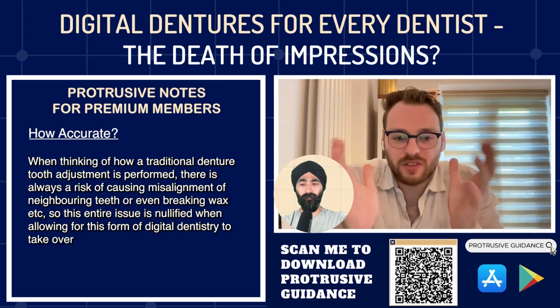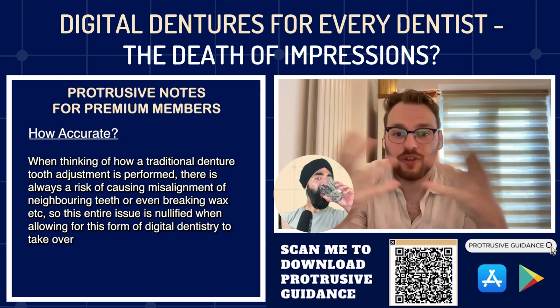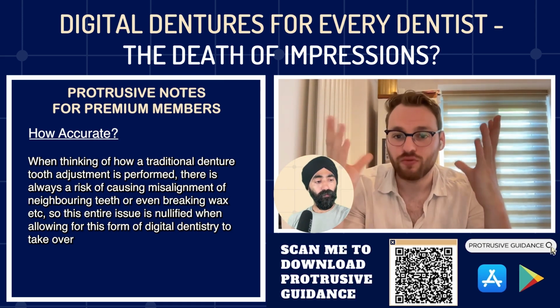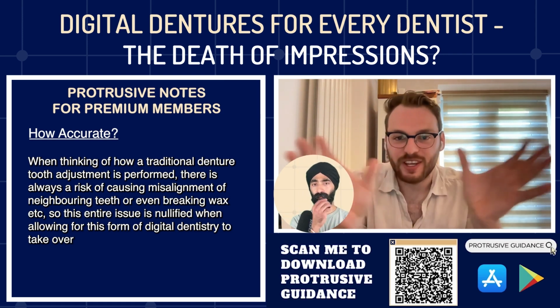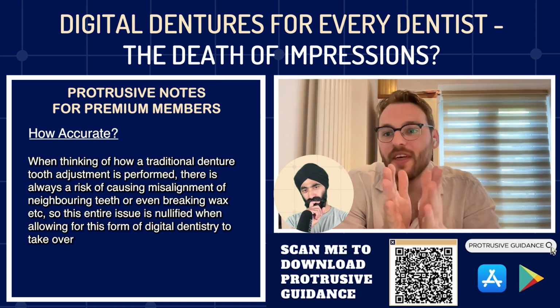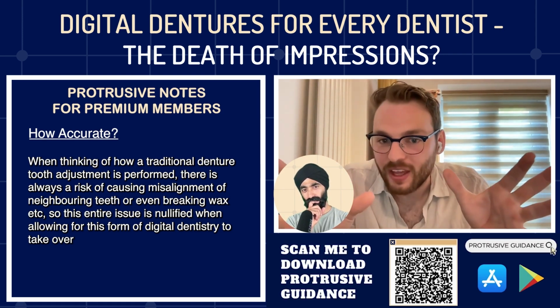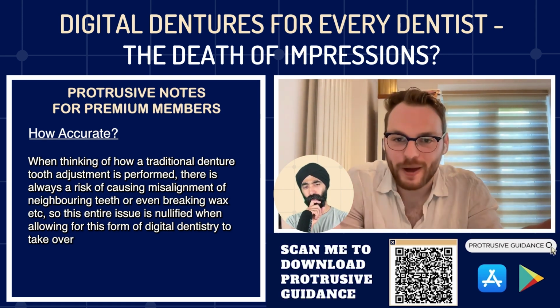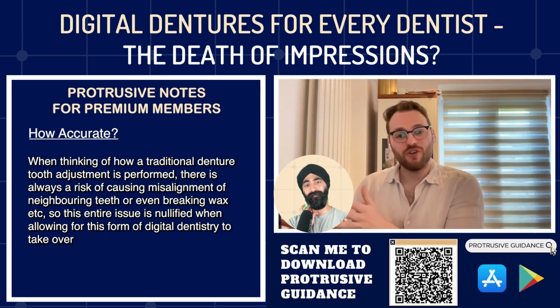But you can always still tweak and polish as if it's almost a set denture, because it's on this full printed monoblock base. It's rock solid. So you can sit there and adjust it. The teeth aren't going to move and they're not going to break off. And then the technician or yourself can even scan that back in and just copy that, a bit like how you do a mock-up in the mouth for a veneer case, and then you scan it and replicate that for your finals. You can do that again.